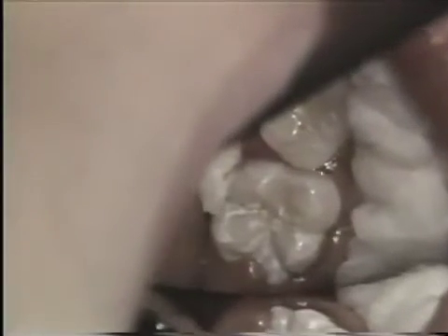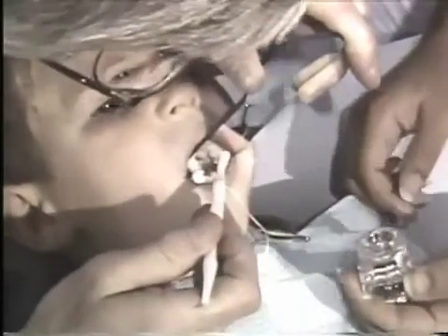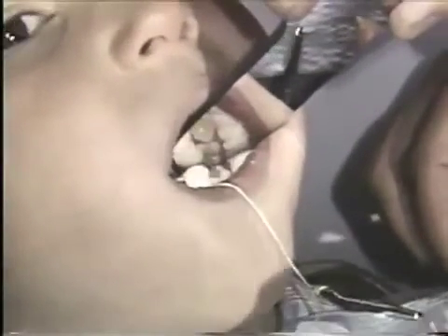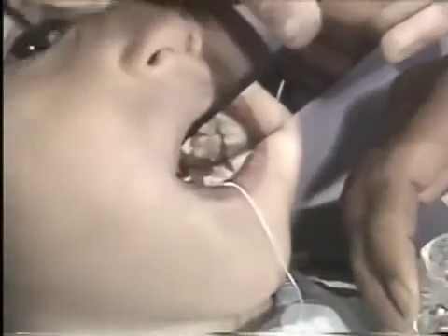Here we see the tooth surface after pumicing. We're ready to apply the acid etching agent — 37% phosphoric acid. Some products use 50%, but the acid is applied and we maintain isolation while the occlusal surface is well moistened. We want to be sure to etch all inclined planes and beyond our potential area to apply sealant. We apply another increment of acid at about 20 seconds after the initial increment, keeping that surface moist so it doesn't dry out and form salts that are difficult to rinse away and may contaminate the sealant bond.